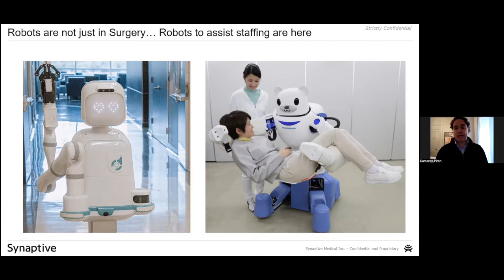So there's a very big gap between the people that are needed to support these services and the highly trained nursing staff and staff to run MRI equipment. And so you're seeing this really big advent of robotics to help out in different ways in the hospital. Not unsurprisingly, this is a Japanese company, and this is for aging patients, to help in geriatric centers with moving patients around, moving them from bed to chair. And this is a robotic company, Moxie. It's in the hospital, actually going around visiting patients' rooms.